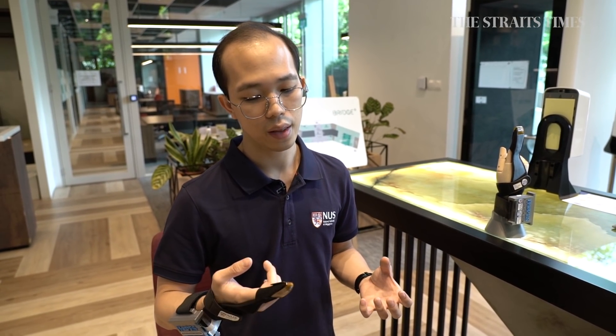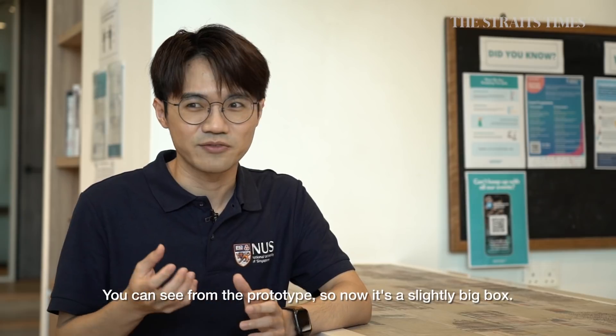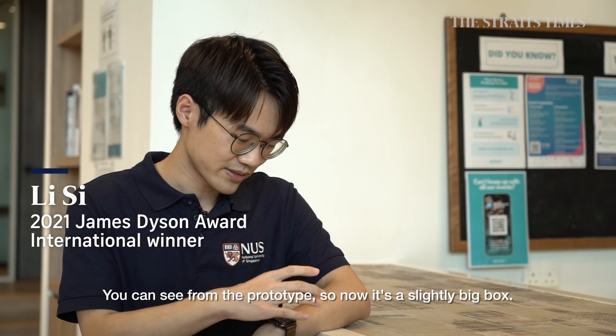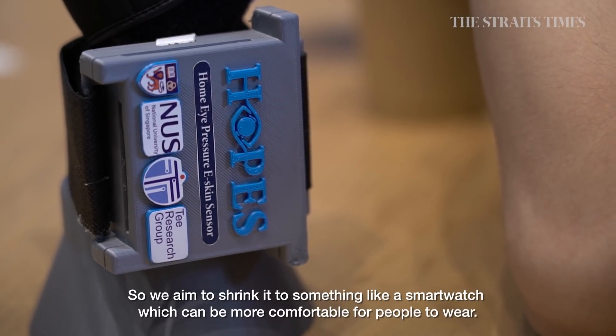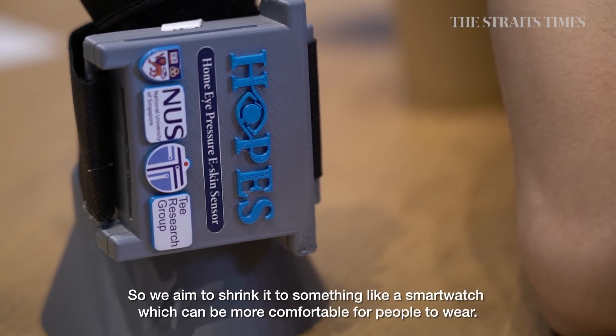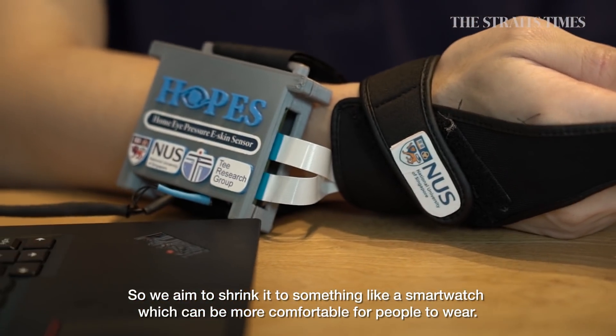On top of that, we also want to ensure that the device fits in with the user's everyday life. You can see from the prototype it's a slightly big box right now. We aim to shrink it to something like a smartwatch, which would be more comfortable for people to wear.